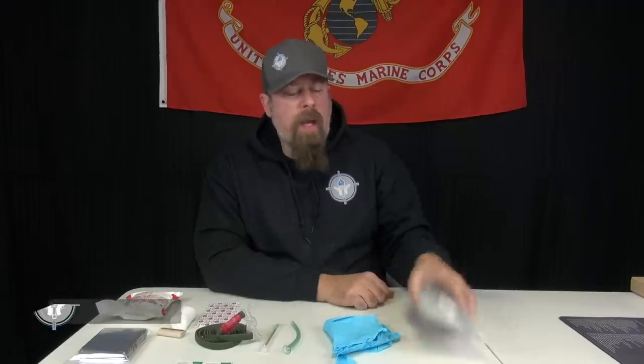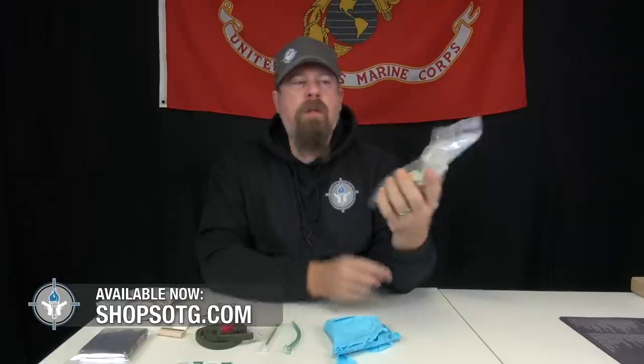Hey guys, I've got in my hands right here the newest, latest pocket lifesaver or combat lifesaver kit from us at Student of the Gun. I won't belabor you guys with the history of the pocket lifesaver — I've talked about it many times — but what is in our kit? What are in most of our kits?